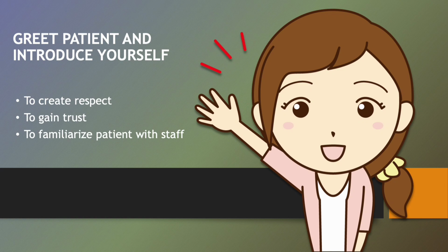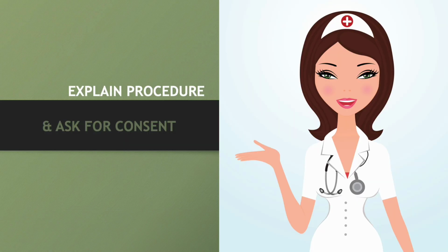After introducing yourself, introduce your assessors of the day and the reasons why they are there. This is done to create respect, to gain trust, and to familiarize the patient with the staff around. Explain to the patient why you are there. Give a brief explanation of the procedure as part of information. Ask the patient for consent once the patient understands the procedure and the reasons why you are there.